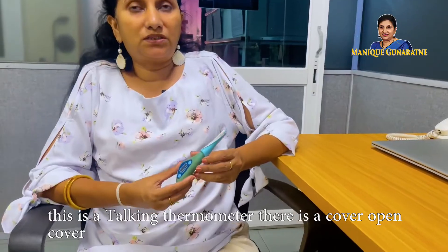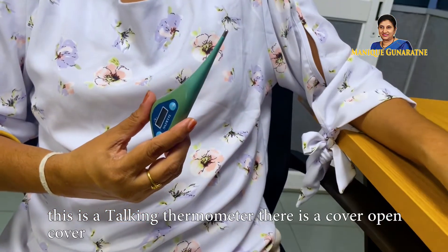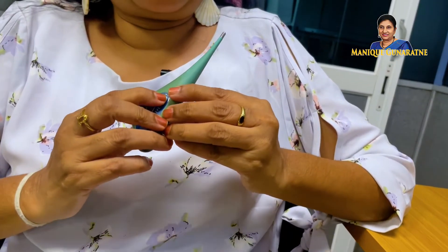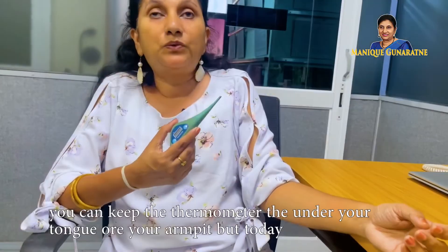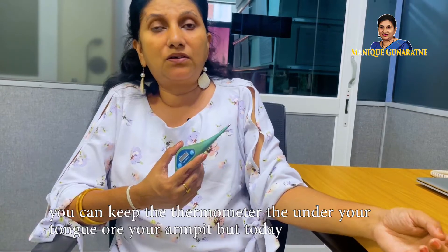This is a talking thermometer. There's a cover — open the cover. You can switch on the thermometer. It said ready.